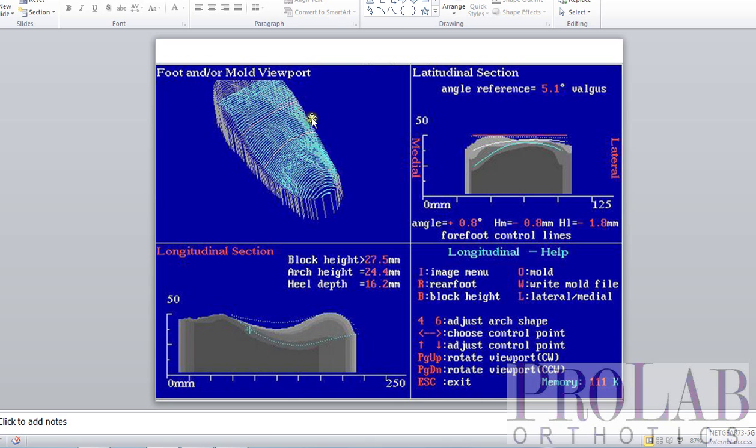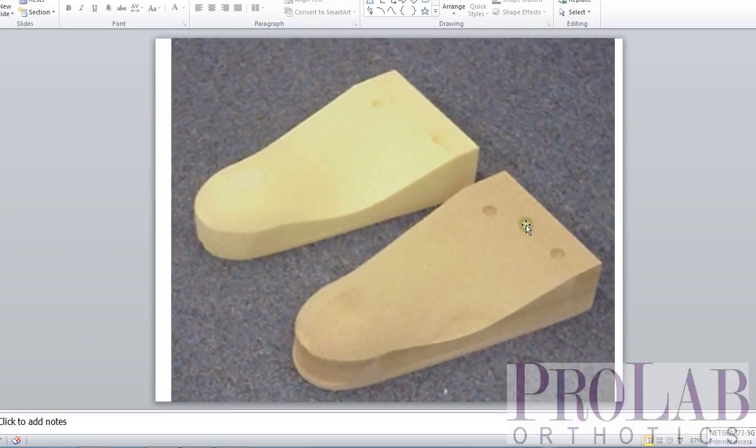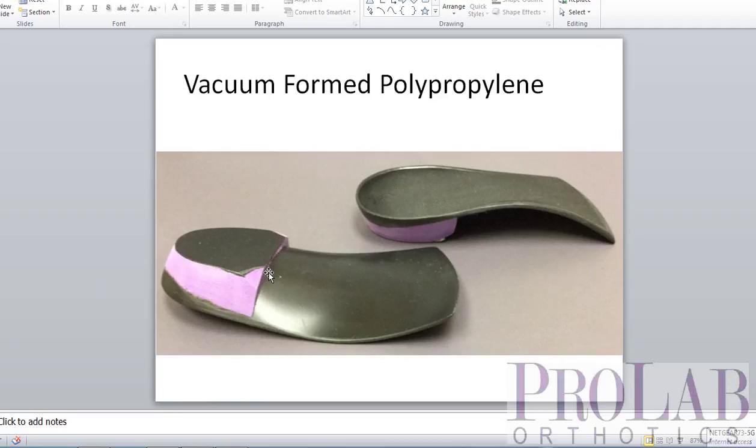From there, we can do one of two things. We can either mill out a positive cast — we create a positive out of very hard wood — and then we can heat up the polypropylene and vacuum form it on top of the orthosis, exactly as we used to do with plaster, and we come up with a vacuum-formed orthotic device.